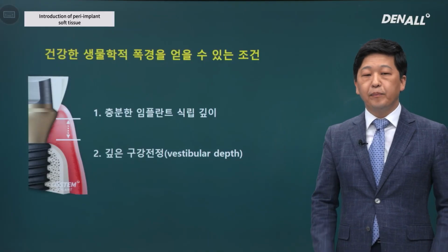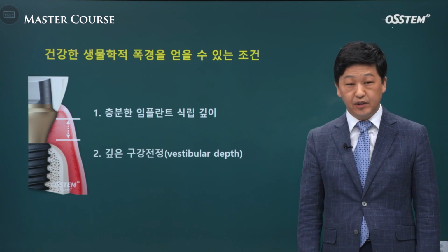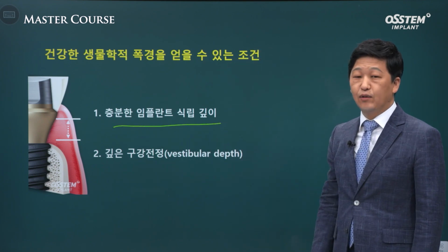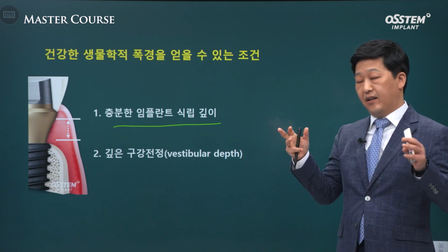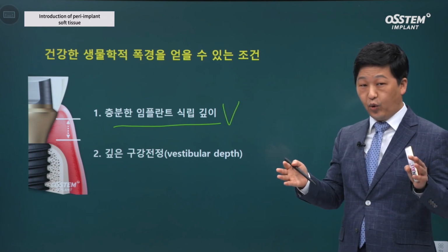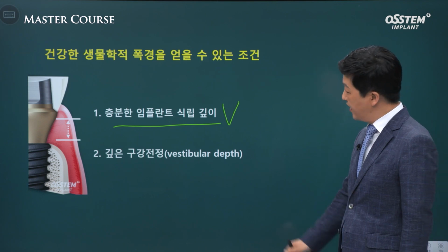Last but not least, finally, how to secure peri-implant tissue. There are two conditions. I would like to end off on this note. First, you need to place implant sufficiently deep. You should not place it excessively deep. The most important is to use one guide or guided surgery to place the implant in ideal position. You can place it with ideal biologic width and form ideal peri-implant mucosa.